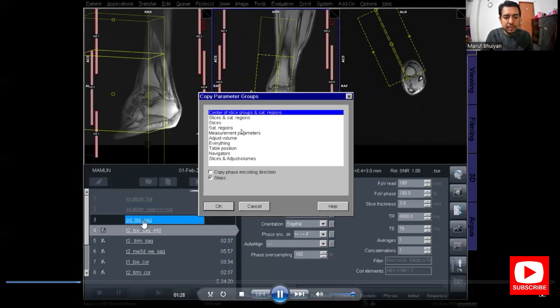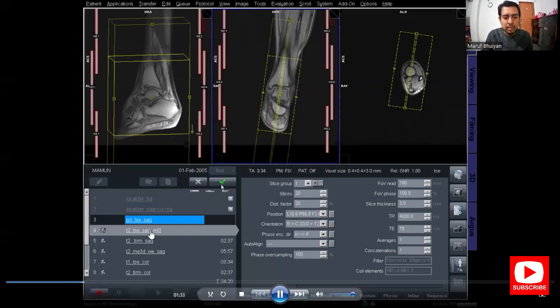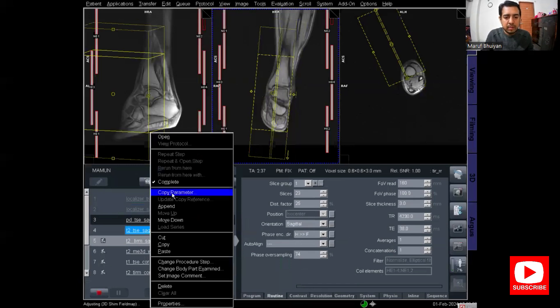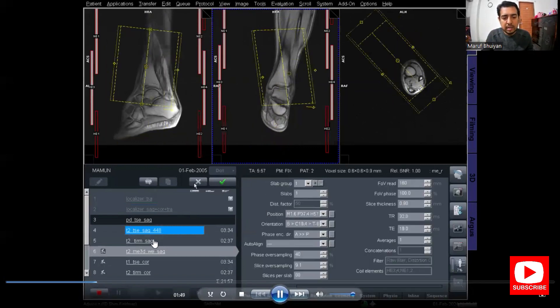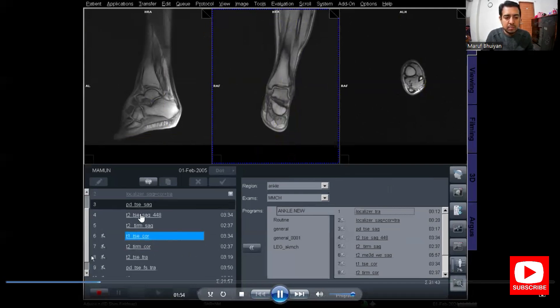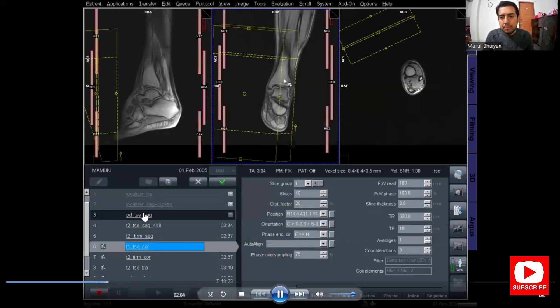As I complete the PD-sagittal planning, the T2-sagittal protocol opens. I copied the plan from the PD-sagittal, so there is no need to plan again. Just copy the slice and saturation from the other protocols. Similarly for the T2-STIR sagittal, I copied the planning from the PD-sagittal and clicked apply. All three sagittal protocols have now been planned and the scans will run consecutively.